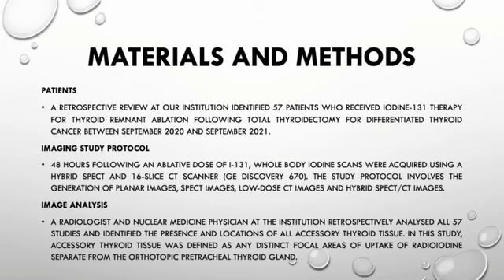So we analyzed about 57 patients who received iodine-131 therapy. All 57 patients had imaging performed between September 2020 and September 2021 following ablation therapy. The scans were performed 48 hours following an ablative dose of I-131. And we used a hybrid SPECT and 16-slice CT scanner.